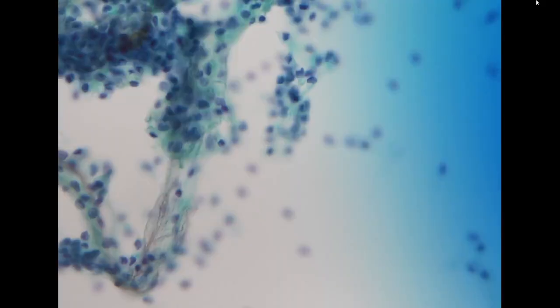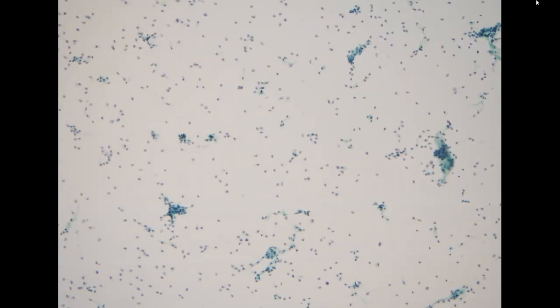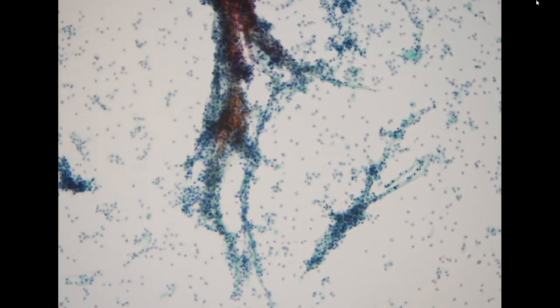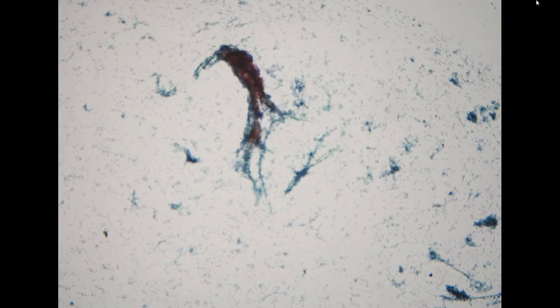malignant potential. The second circumstance is when you see detached fragments of papillary architecture lined by low-grade looking cells. At that time, you can also highly suggest that this is a specimen of low-grade urothelial neoplasm. So here we see some capillary meshwork lined by these monotonous looking urothelial cells. So this is suggestive of a low-grade urothelial neoplasm.